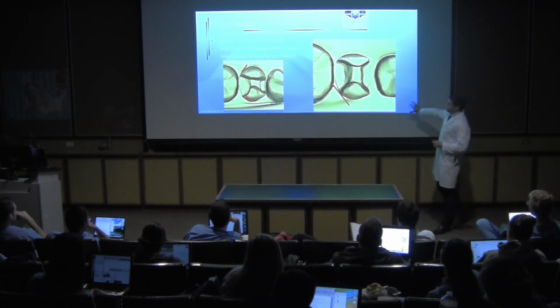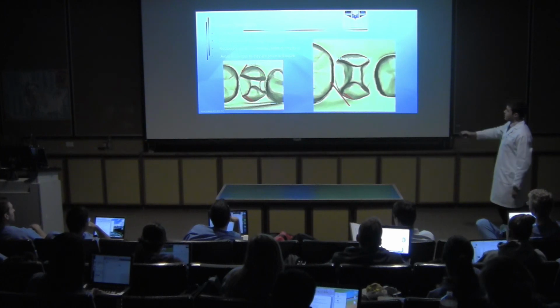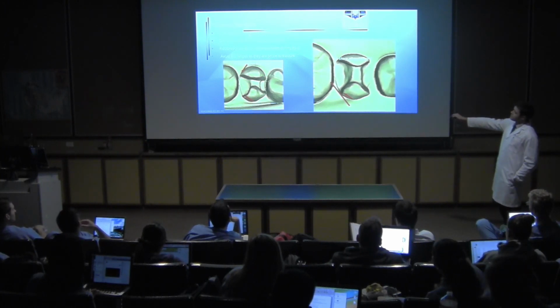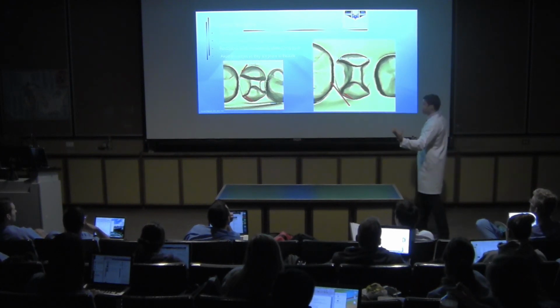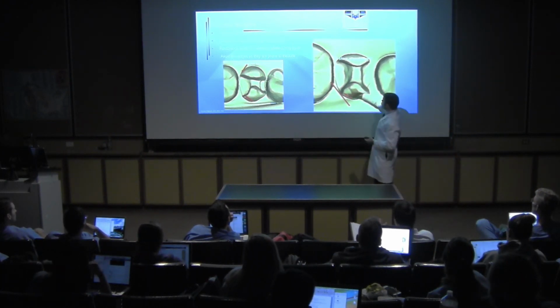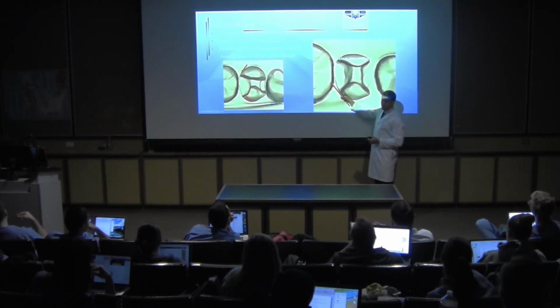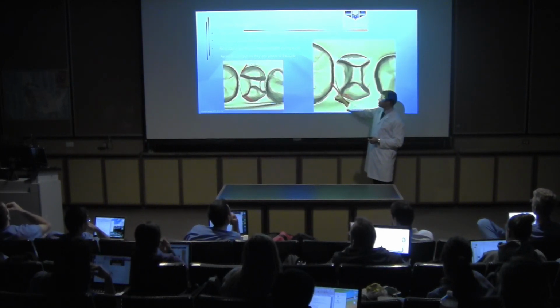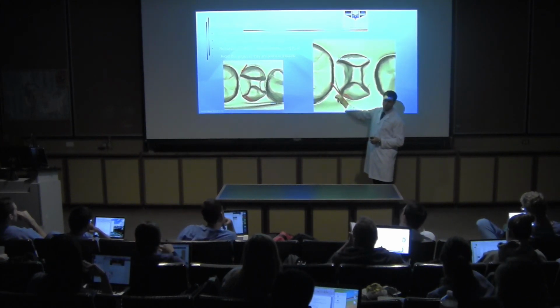We can see here another important guideline. Thin ceramic margins are prone to fracture, like it's a brittle material. So, too sharp like this, we almost have a bevel, and probably your indirect restoration will fracture here, and we will have an open margin here.